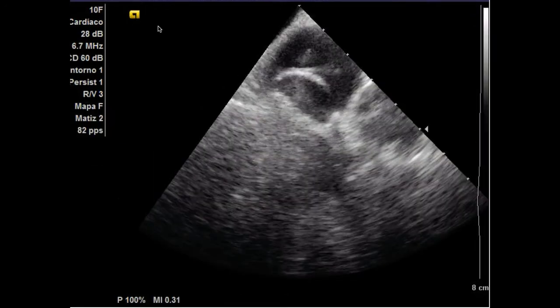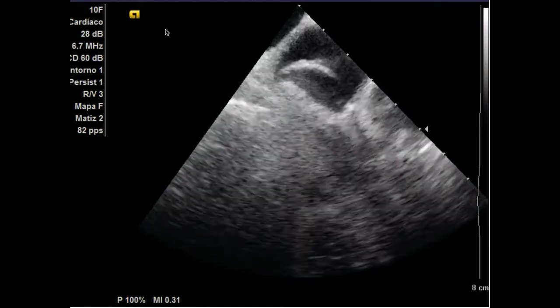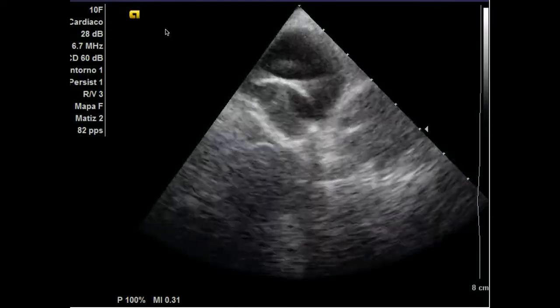When we are done with the left structures, we need to go to the right structures. The right pulmonary veins are technically more difficult than the left. We need to pace the diaphragm to avoid phrenic palsy. This is the balloon inflated in the right superior pulmonary vein.